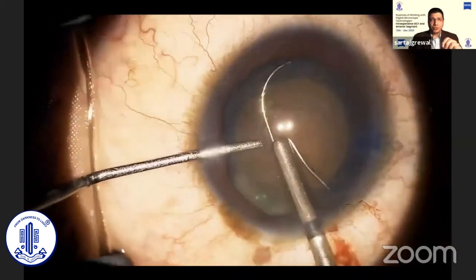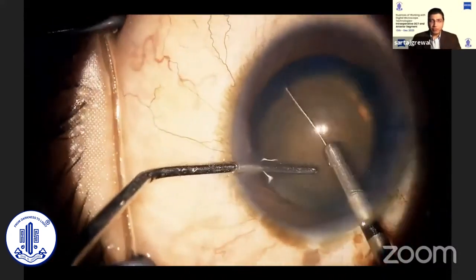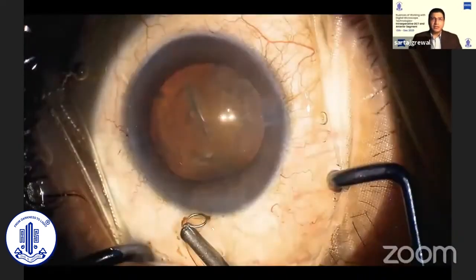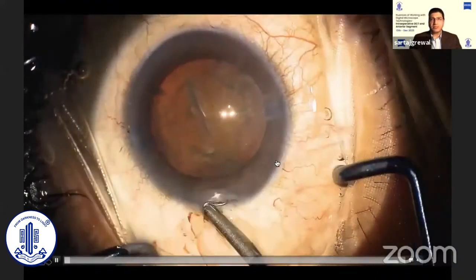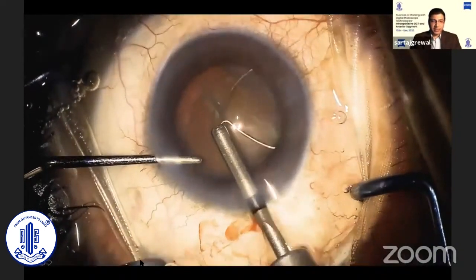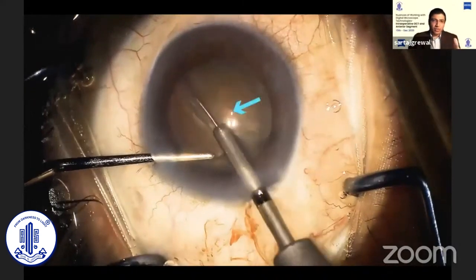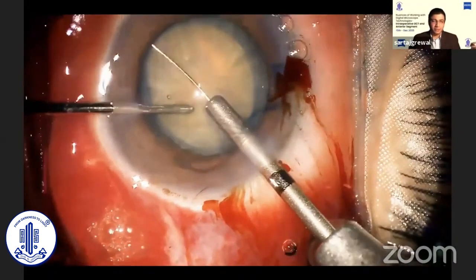To get this just right, you start by expanding the loop gently till you reach the equator, then gently rotate the instrument clockwise, keeping track of any movement of the nucleus. If the nucleus begins to move, compensate by further expanding the loop. As you expand the loop and it crosses the equator and comes posterior to the nucleus, it can be seen as a shiny reflex. Even in dense white cataracts, the reflex is still visible. This reflex is a very important guide to make sure that the filament is in the correct plane and is helpful in aligning it absolutely vertically, ensuring that the filament goes all the way to the posterior pole before you retract.